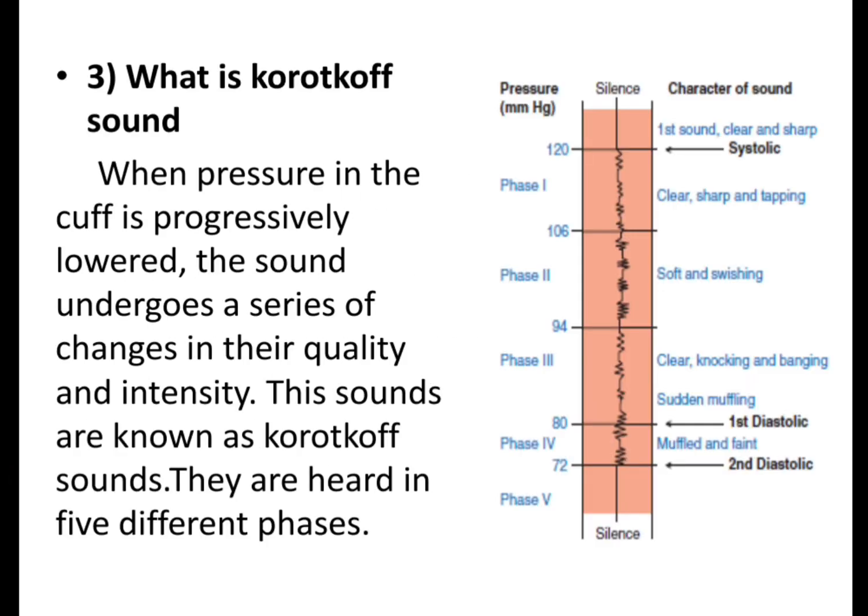Next question: what is Korotkoff sound? When pressure in the cuff is progressively lowered, the sound undergoes a series of changes in its quality and intensity. These sounds are known as Korotkoff sounds. They are heard in 5 different phases.